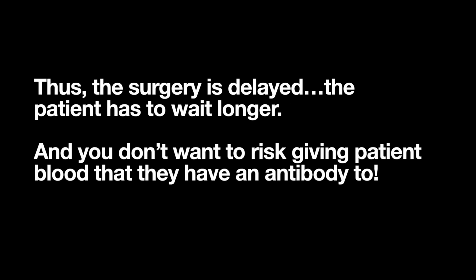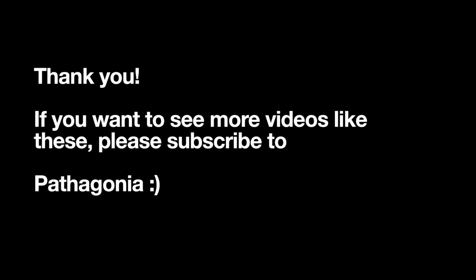However, if the antibody screen is positive, then you saw what we had to do with the extended antibody panel, which can take several hours sometimes. Thus, the surgery is delayed and the patient, who's already probably worrying about the surgery, has to wait longer. Plus, you don't want to risk giving the patient blood that they have an antibody to, for the aforementioned reasons. So that was a quick overview of what a type and screen is.